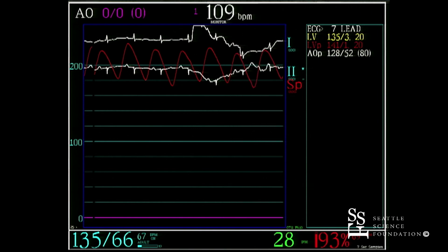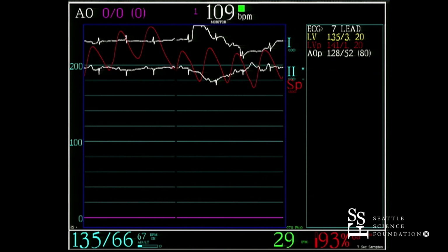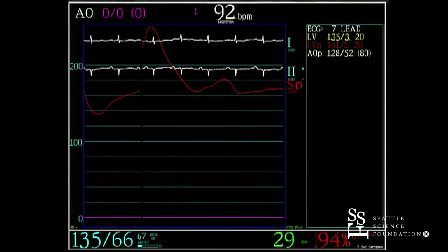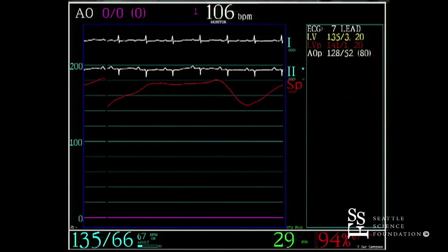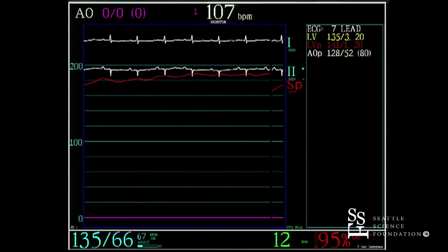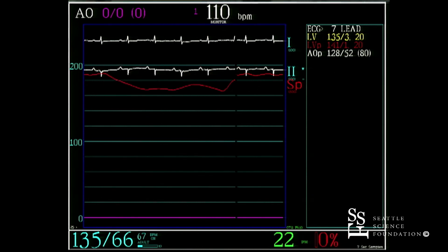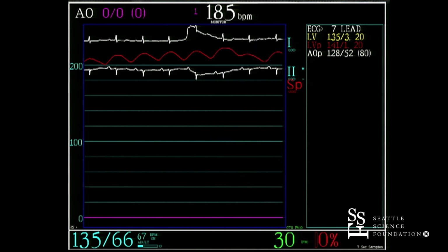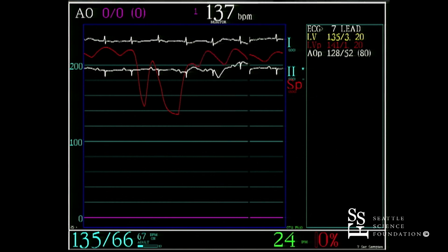So what you're going to basically do is if we compress both the arteries, you're going to see it go flat, okay? Now, if I want to make sure there's still patent hemostasis here, I'm going to let it up and see if it'll still start tracking. There's some cyclical component to it there. There's really not, there's a little bit of a waveform there, but not a lot. There it goes. There it goes. So I'm holding pressure over the ulnar right now, and there's still flow down the radial, which is good. That's what we want to see. Okay? Very good. Thank you, John.